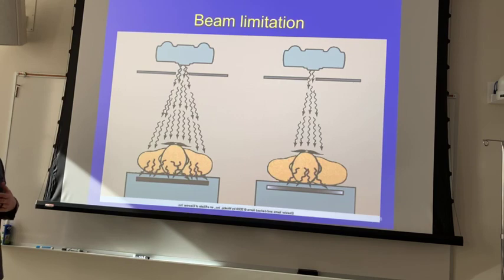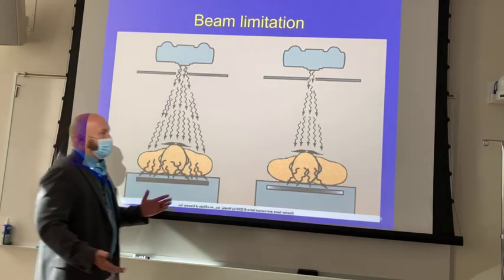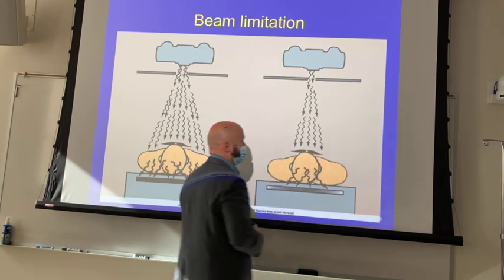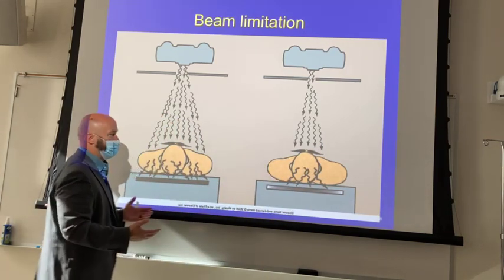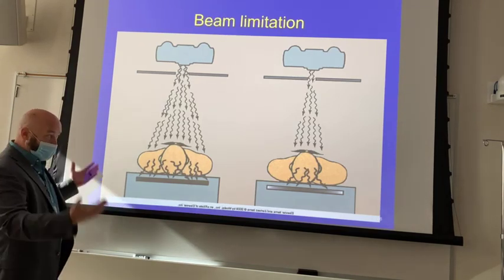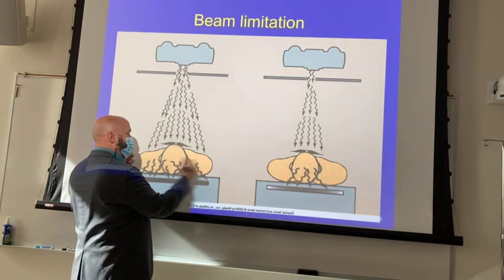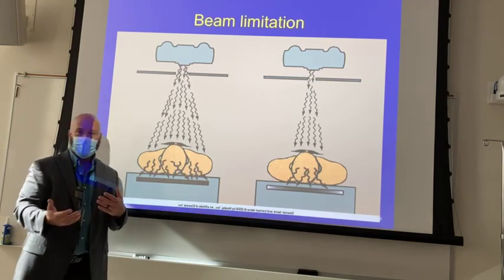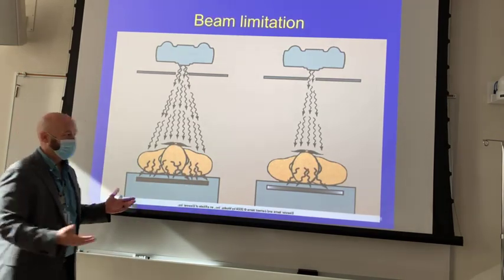Now, when we increase our collimation, what we do is we expose the tissue to less radiation, right? So in our interactions inside of the patient, if we open our field size up, we decrease our collimation, then we've got all those interactions occurring all the way across the image, right?